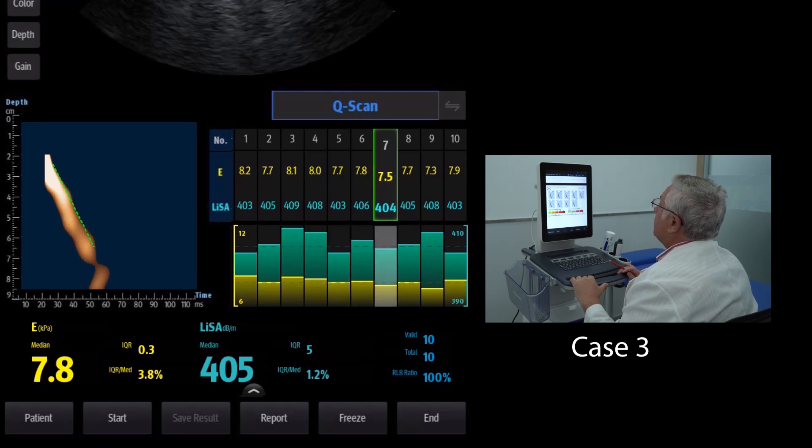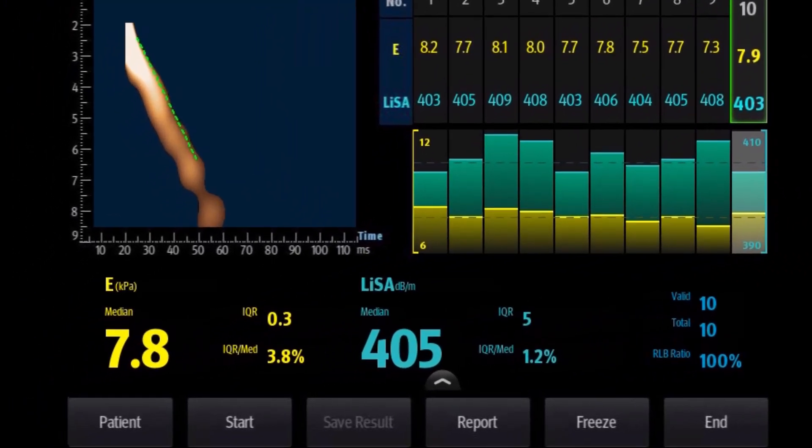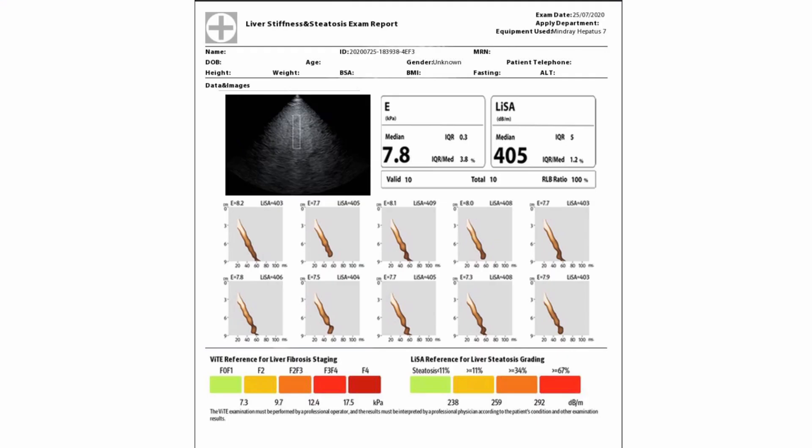Case number three: this is a patient with a severe fatty liver. The median E is 7.8 kilopascals, and the median LISA is 405 decibels per meter. Both values are acceptable because the IQR divided by the median E-value is 3.8%, which is less than 30%, and the IQR value for LISA is 5, which is less than 40. When we match this data to the steatosis and histopathology table, this patient is at risk of severe fatty liver. The E-value is a bit high, which is probably caused by the severe fatty liver. We also need to check whether this patient has hepatitis B, hepatitis C, alcoholic liver disease, or other liver diseases before making a comprehensive diagnosis.